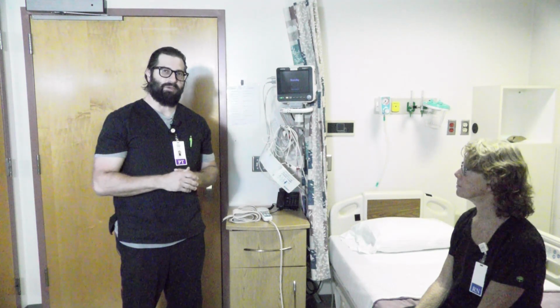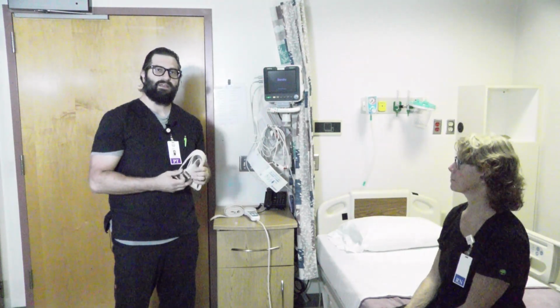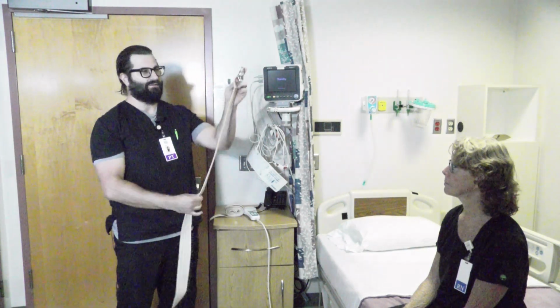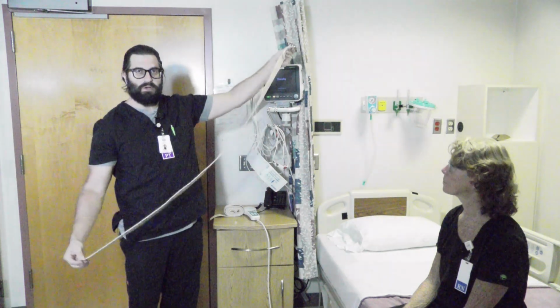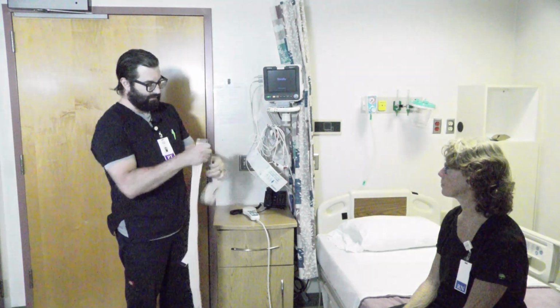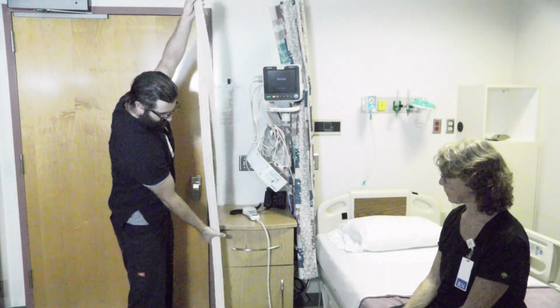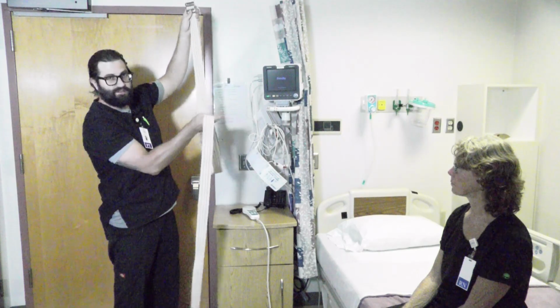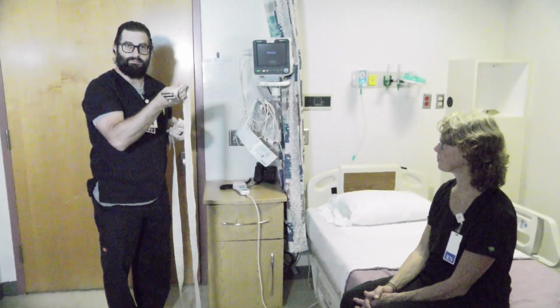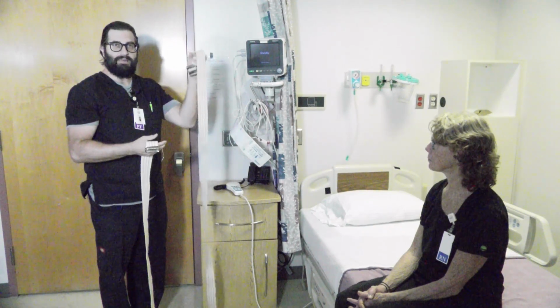A couple things about gait belts. We have different sizes. So as our ever-increasing population continues to grow out, this is a standard gait belt size that you will see on most units, okay? But if I hold up a larger one, you'll see the difference in size here. So there's a lot more addition to this gait belt. So this would be a bariatric gait belt and then a normal size gait belt, okay? So when in doubt, when you go into an individual's room, I would have the bariatric gait belt, okay?